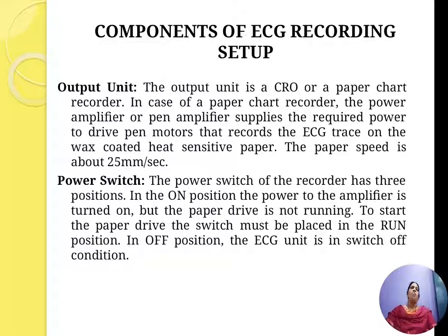If it is in the on position, only power supply is provided to the device, but your paper will not be driven. So to start the paper drive, you have to keep the switch in the run position, and in the off position the ECG unit is switched off.